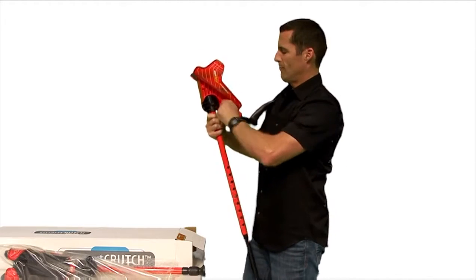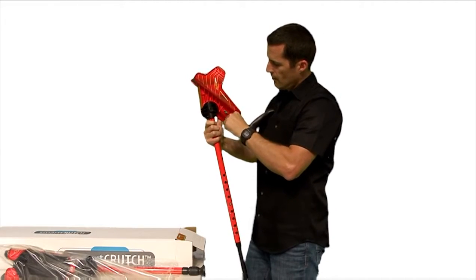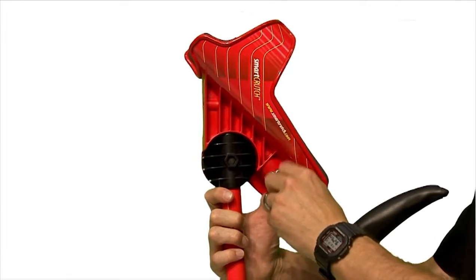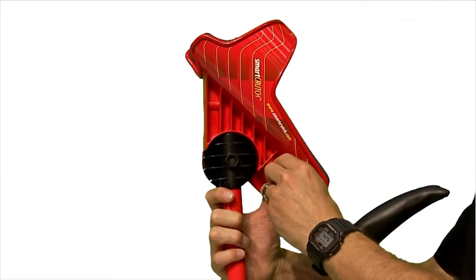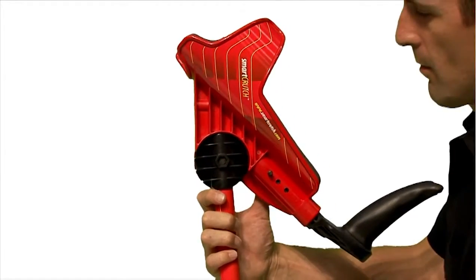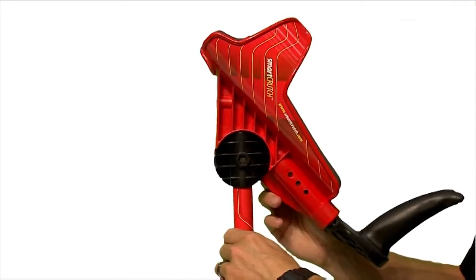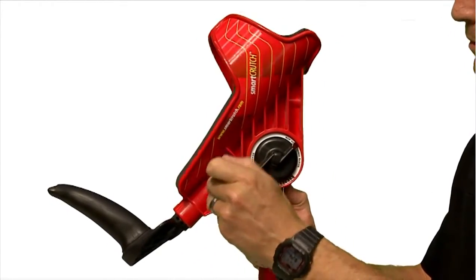If your elbow is hanging more than 1 inch off the end of the platform, loosen and remove the silver-colored wing nut. Push the bolt and remove from the other side. Once removed, slide the grip out to the next position.